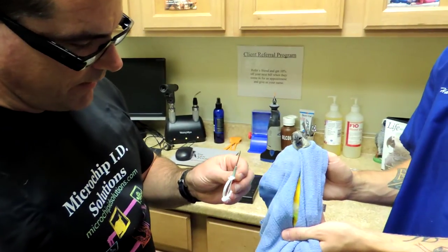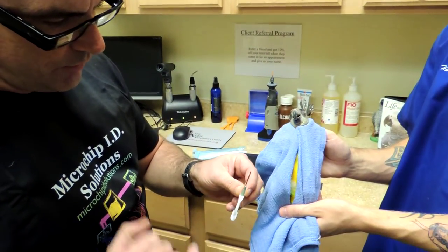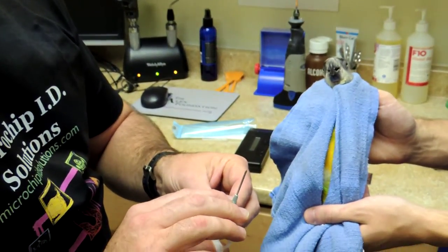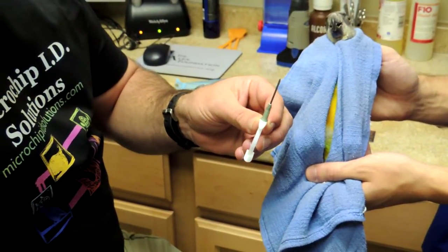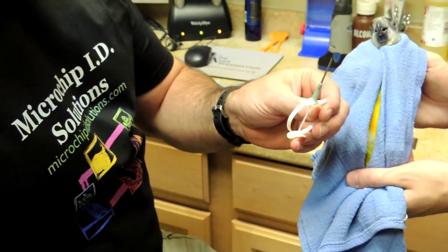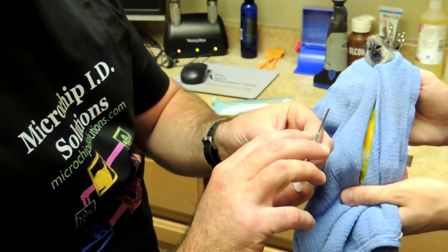Here's the needle to put it in — the microchip is embedded within that needle. This needle is a 15 gauge, and the typical needle for a microchip is a 10 gauge, so it's much, much bigger. In fact, this whole needle will fit into the hub of the 10 gauge needle.